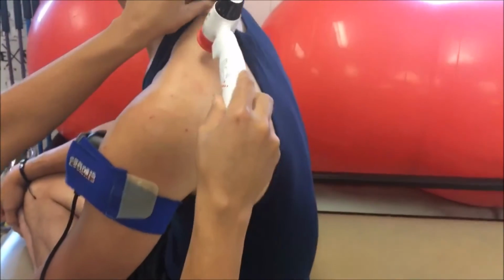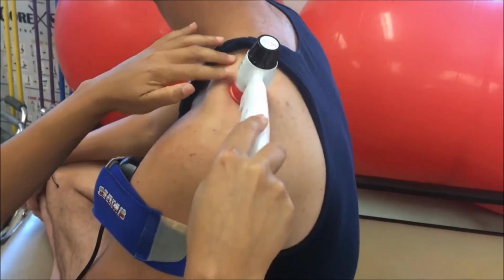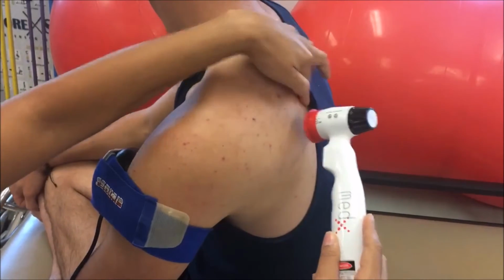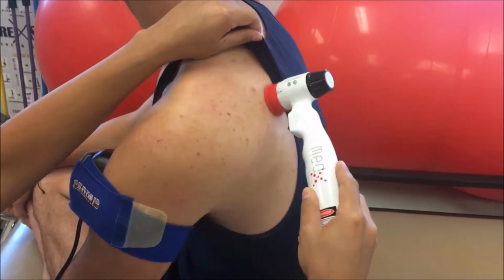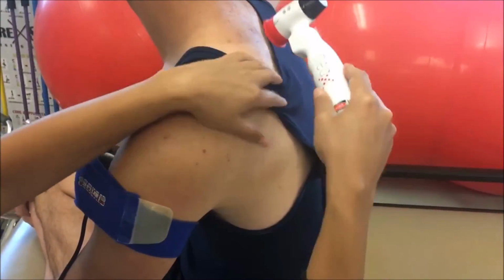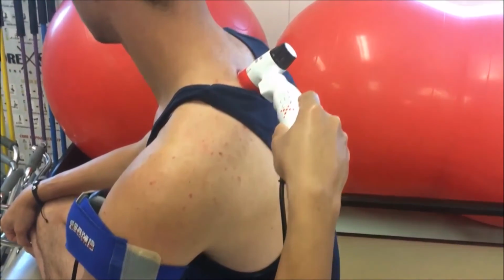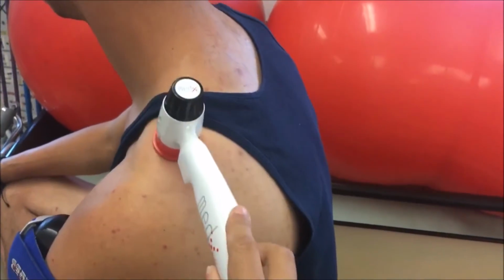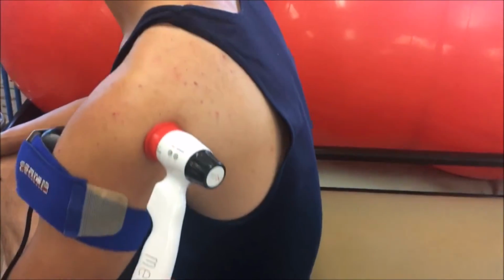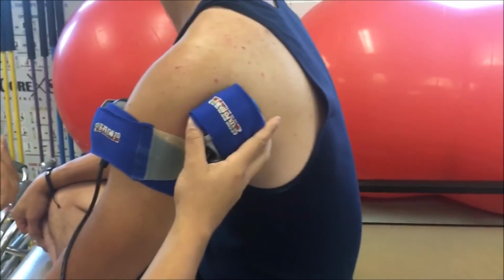You could go on the supraspinatus. You could do it around the infraspinatus, and also on the traps, the upper traps, and just move it along that area of pain. Do it on the shoulder too. Or you can also place two SLDs. You can put one on the back.